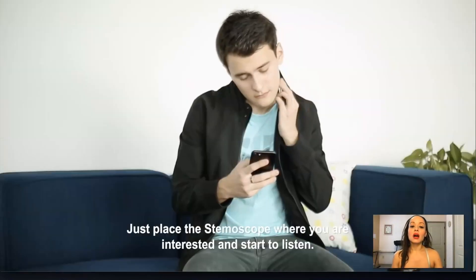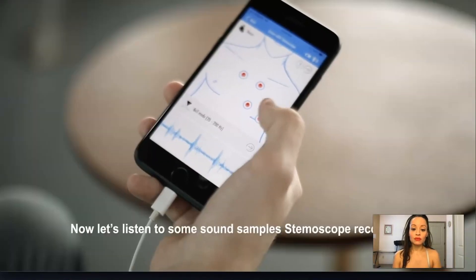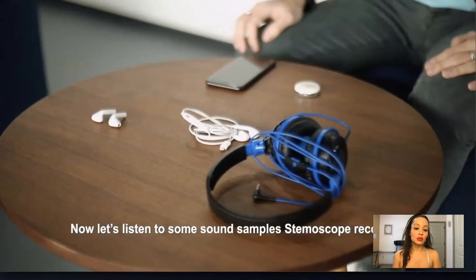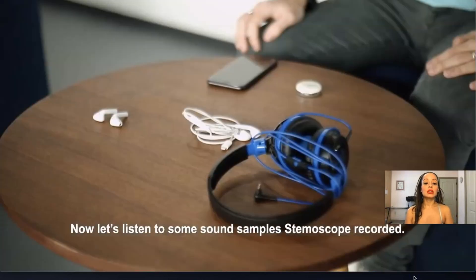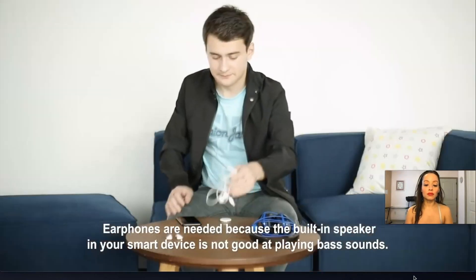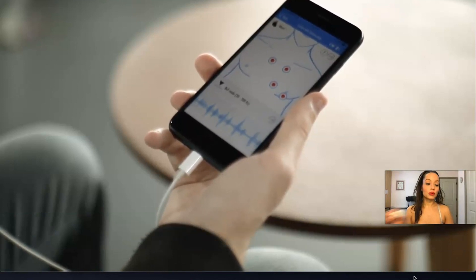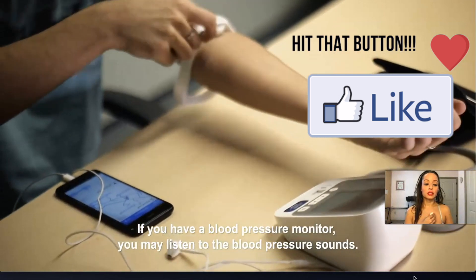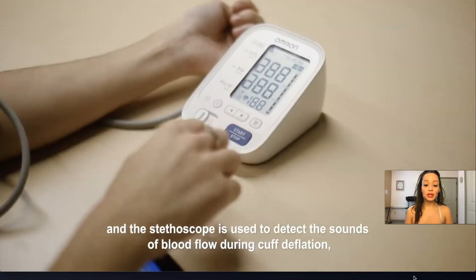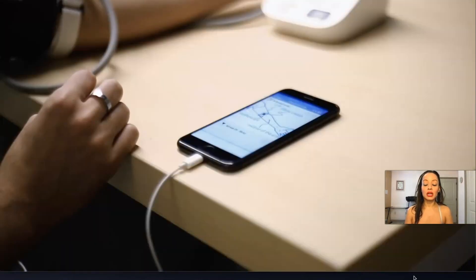As you can see here, it tells you where to auscultate, so it's very easy to use. You can press the area where you're recording and then play it back. It is recommended that you listen with headphones because the smart device is not good at playing bass sounds. You can put it over your own heart and listen to the different areas to learn how to take a blood pressure. It's really an amazing tool.